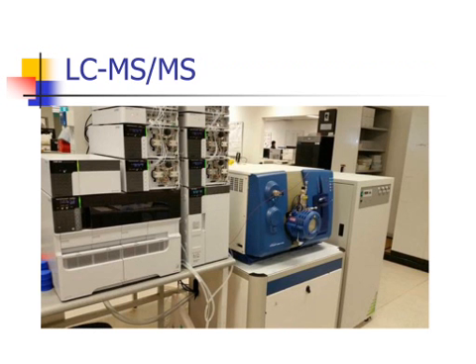So many labs decided to make the move to LCMS, tandem mass spectrometry, using triple quadrupole instruments for measuring vitamin D. But there's always the issue with just the sheer number of samples. It's often quite difficult to do, so you need as simple a method as possible, which takes the least amount of staff time and instrument time to get all the samples done.